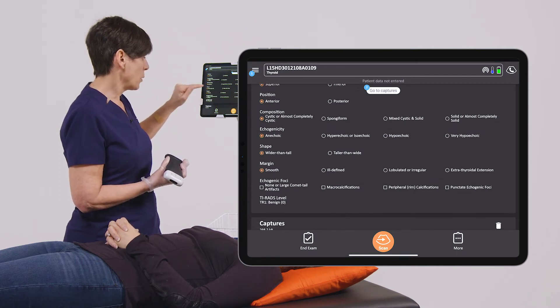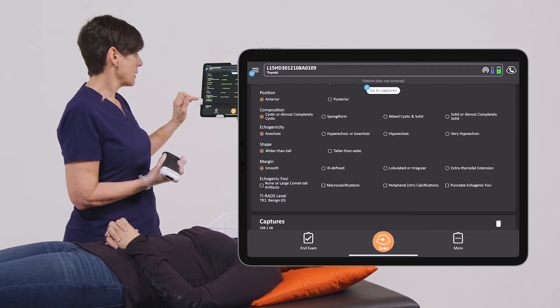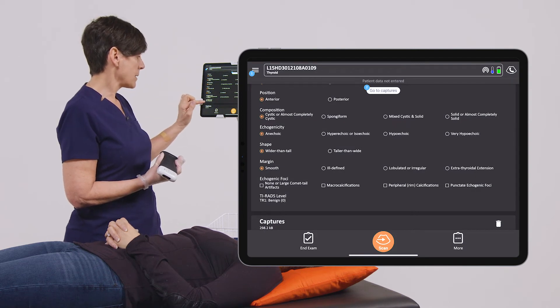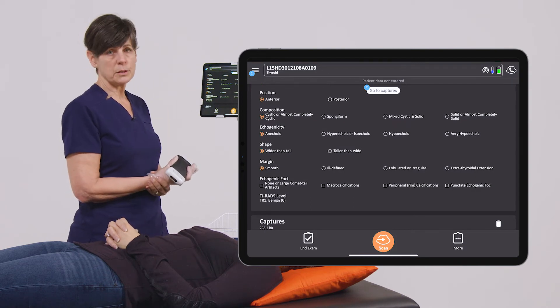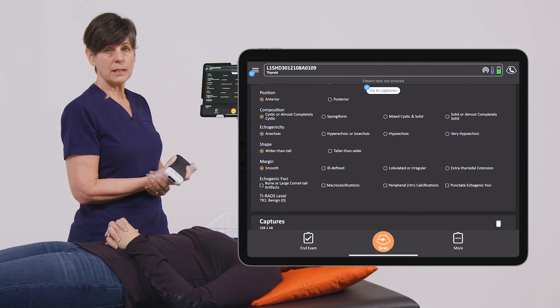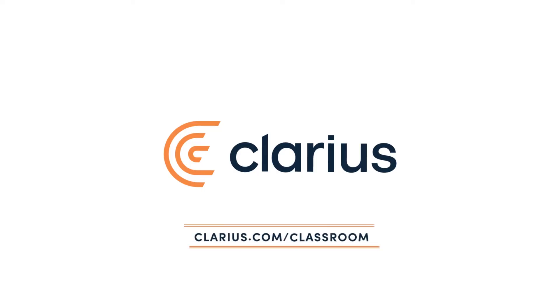There are no echogenic foci, and this gives us a TYRADS score of zero, which is indicative of a benign lesion. Thank you very much.